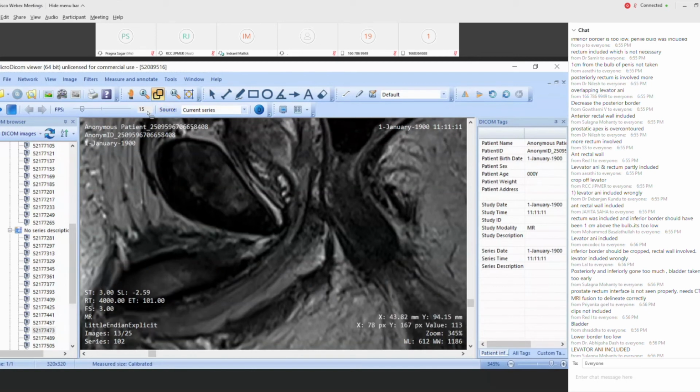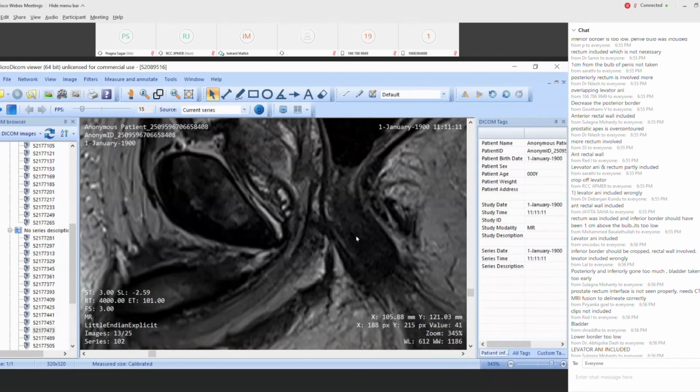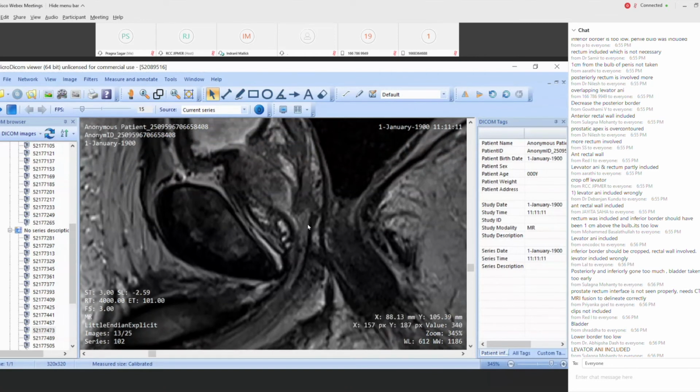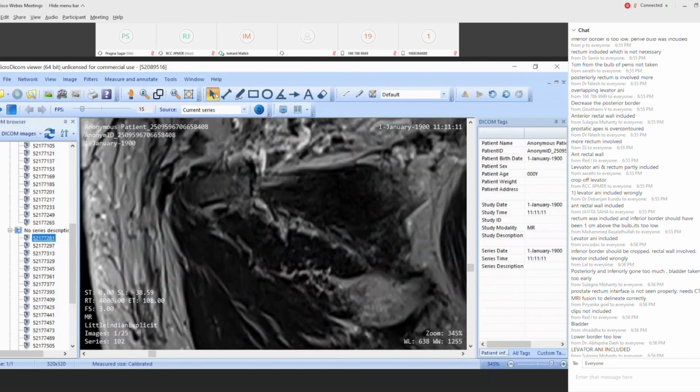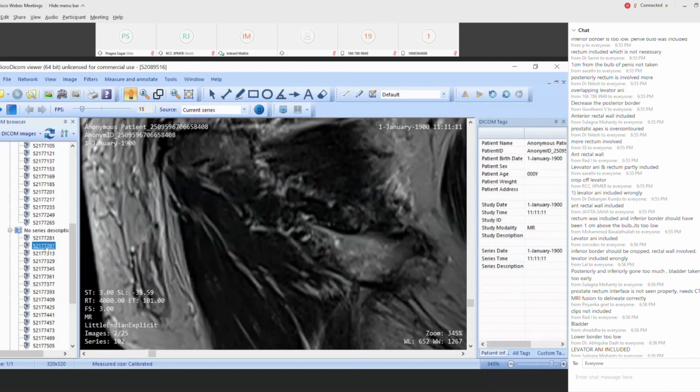The reason being that when we started our service and I had to decide what to do, I wanted to keep things really simple. It's very difficult to do image guidance when you have so many volumes in the prostate gland. So we don't separate those volumes inside the seminal vesicles. It makes things a lot easier for our technologists when they do image guidance. So far, I don't think this has caused any additional toxicities, but that's my impression. There are some trials which have differential volumes, but we don't use it.